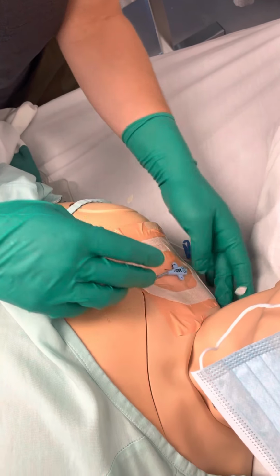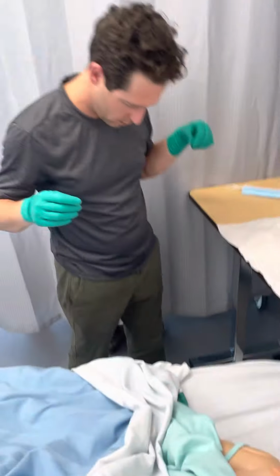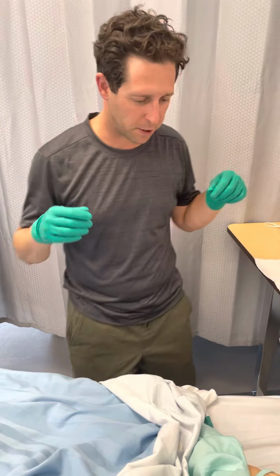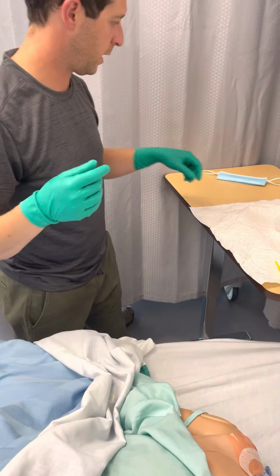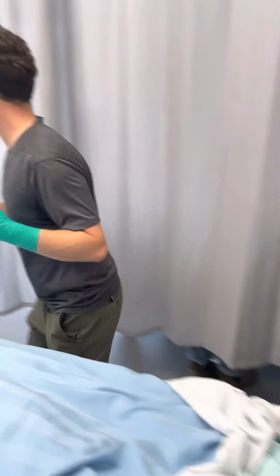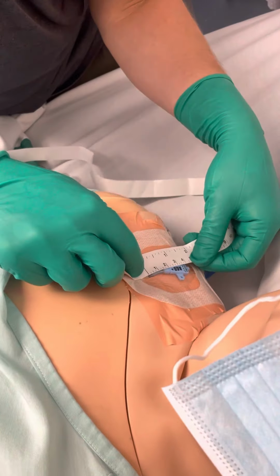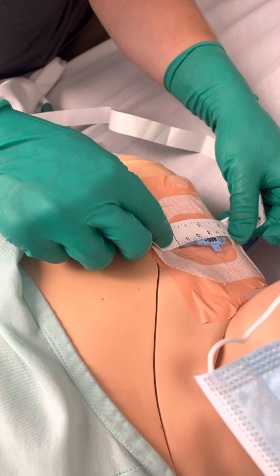Okay. The last little bits of garbage out of the bed. Okay. I'm going to measure. I take my measuring tape, which is right here. I need measuring tape. I didn't have to leave the room, it was right here. I take my measuring tape and I go from the insertion site to the end of the hub. So that's just a touch over 4 centimeters.